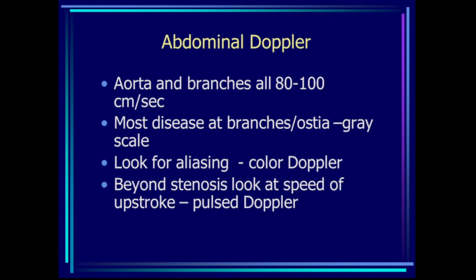Most atherosclerotic disease in these branches occurs at the ostia, where the vessels are arising from the aorta. We'll look at those areas with grayscale. After the grayscale evaluation, color Doppler is applied, and we're looking for focal areas of aliasing — the aliasing giving us a sign that we have a high-velocity area. Then pulsed Doppler interrogation is performed right at the area of color aliasing to look for a peak systolic velocity. It's also important to look at the vessel beyond the level of the stenosis using pulsed Doppler and waveform analysis.